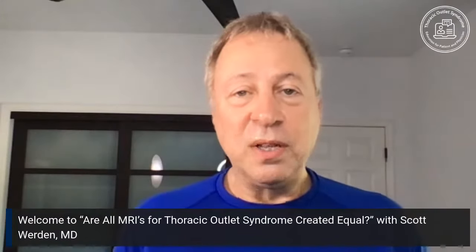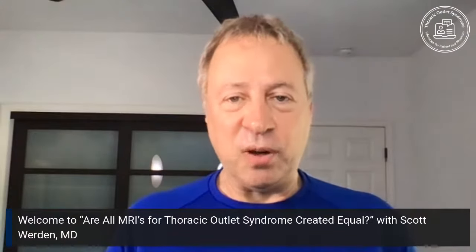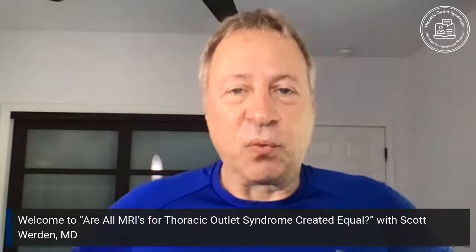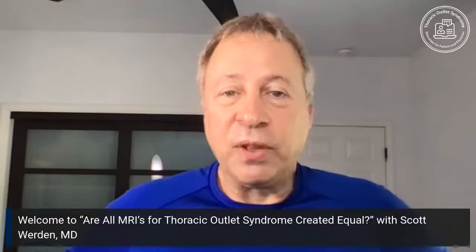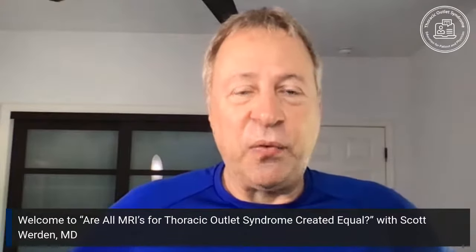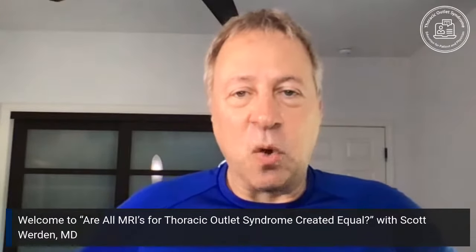So number one, they're always short. Number two, they're really not images or reports based on thoracic outlet syndrome. They're based on the brachial plexus. If you look at the header of a report, it'll say MRI of the right brachial plexus or MRI of the left brachial plexus without contrast, something like that. And then the radiologist will generate 4 or 5 sentences and say, it looks normal to me.